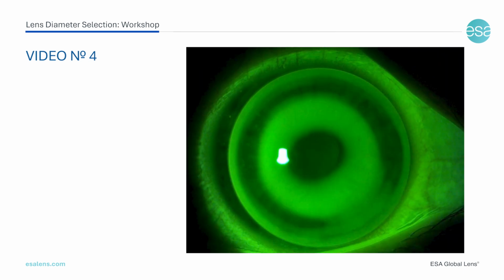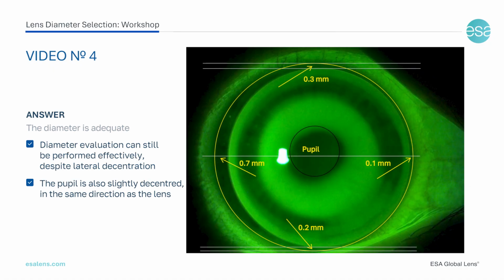What do you think of the diameter of this lens? What is your proposed action? In this case, the lens diameter is adequate.